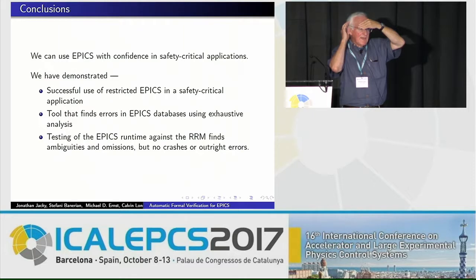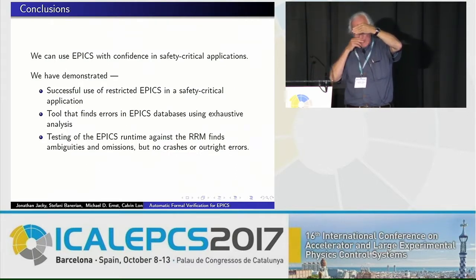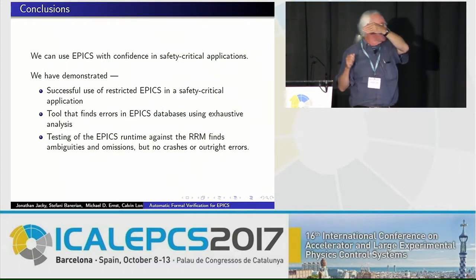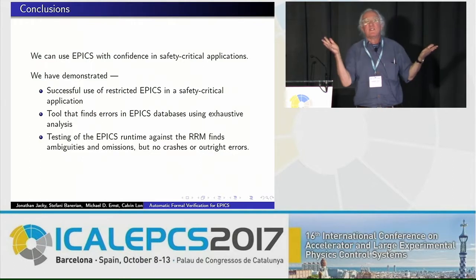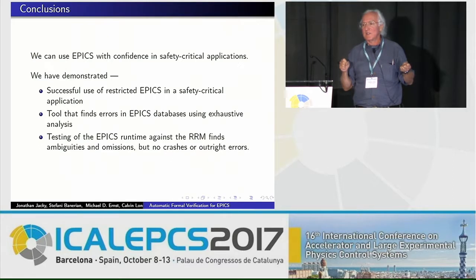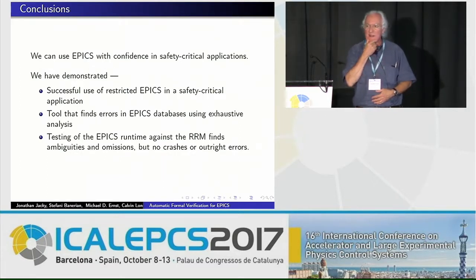3.15.2. But actually, that's an interesting point. One of the things that the trace verifier found is that we changed the version of the EPICS calc library in the course of this development. And the computer science people who built and were running the trace verifier found a discrepancy because they were using the new version of the calc library, but our production version of the therapy control program used the old one, and they found a bunch of things that didn't work. Well, of course, they did work in practice because we hadn't upgraded to the new version of the calc library. But based on what they told us, we were forewarned about this difference, which was in fact a breaking change. We looked back at the release notes and we had overlooked that. I guess we have to change our program.